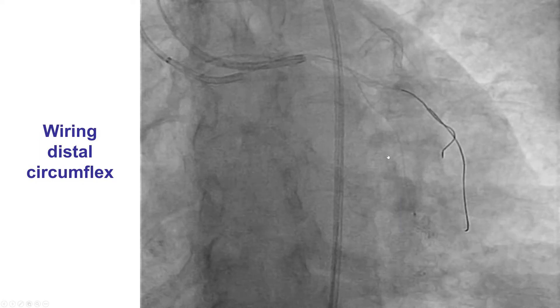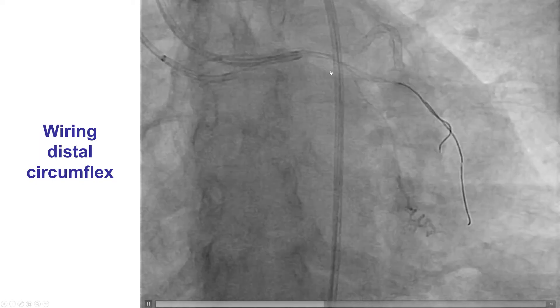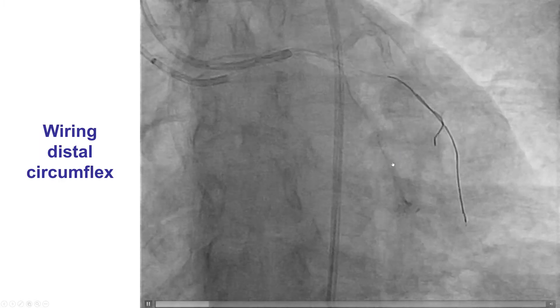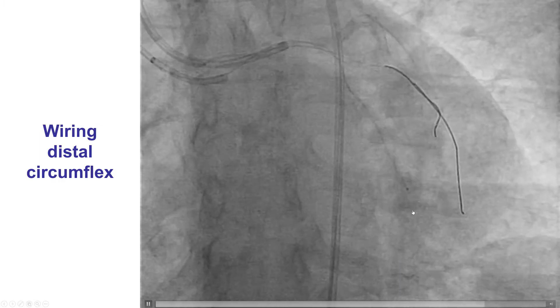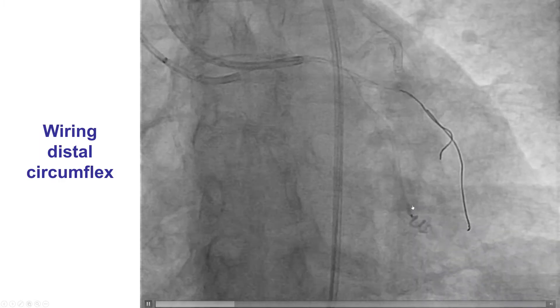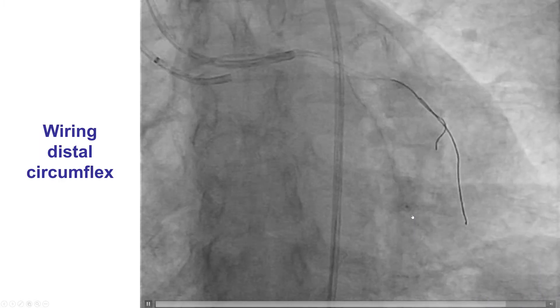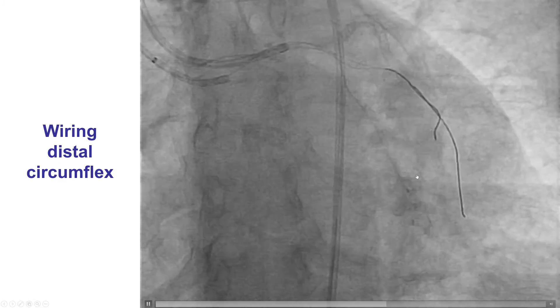Given the poor flow in the distal circumflex, we used another guide wire to wire the distal circumflex. We performed a small injection through the microcatheter to confirm that we were indeed in the distal true lumen, which was the case.